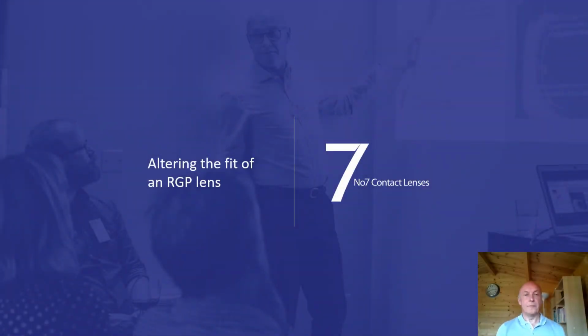In this section, we'll look at how we alter the fit of an RGP lens. So if we've got a lens that's fitting, we look at it, we're not happy with the fit, what alterations do we need to make, and how do we make these alterations?